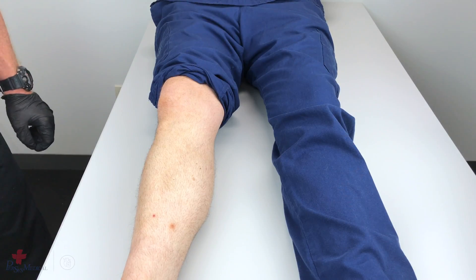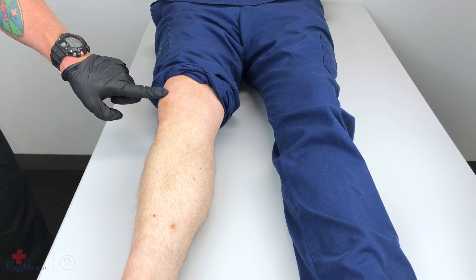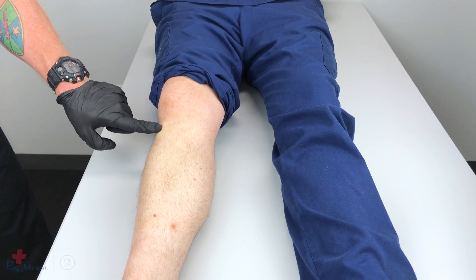To locate the proper tibial insertion site on the anterior of the shin, below the kneecap, palpate the tibial tuberosity.